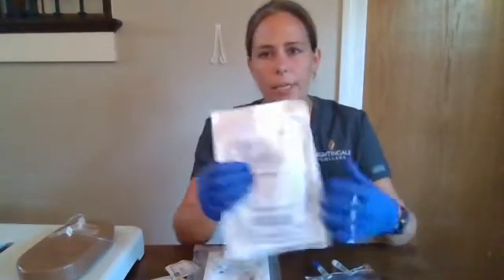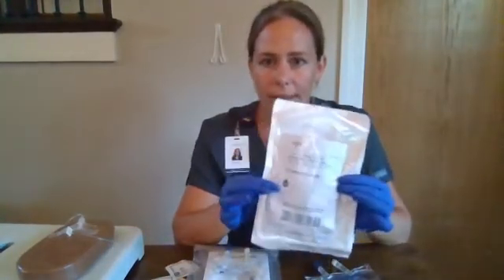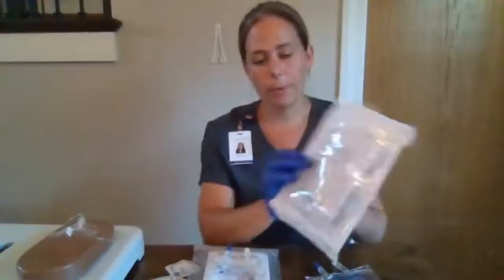For our primary tubing, we have a macro drip set, so 15 drops per milliliter.